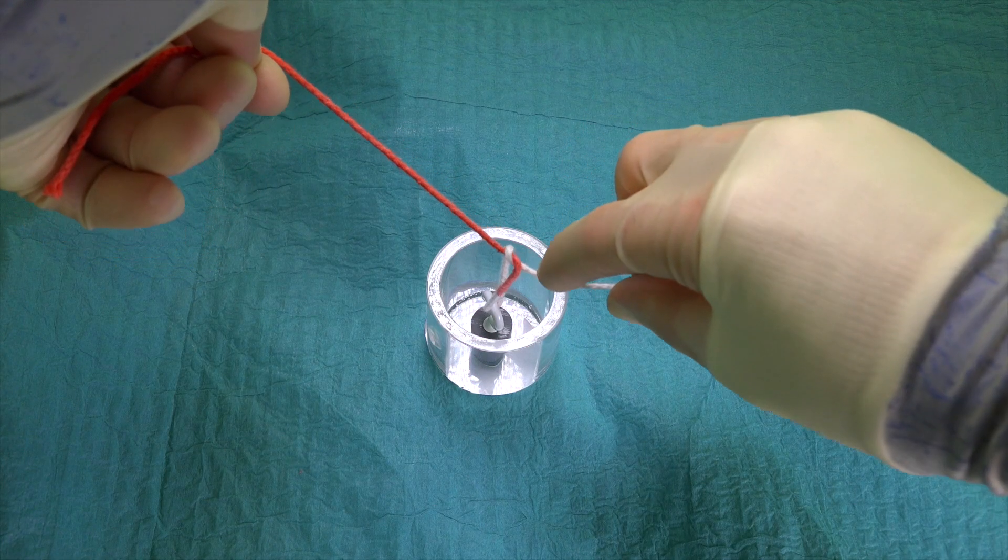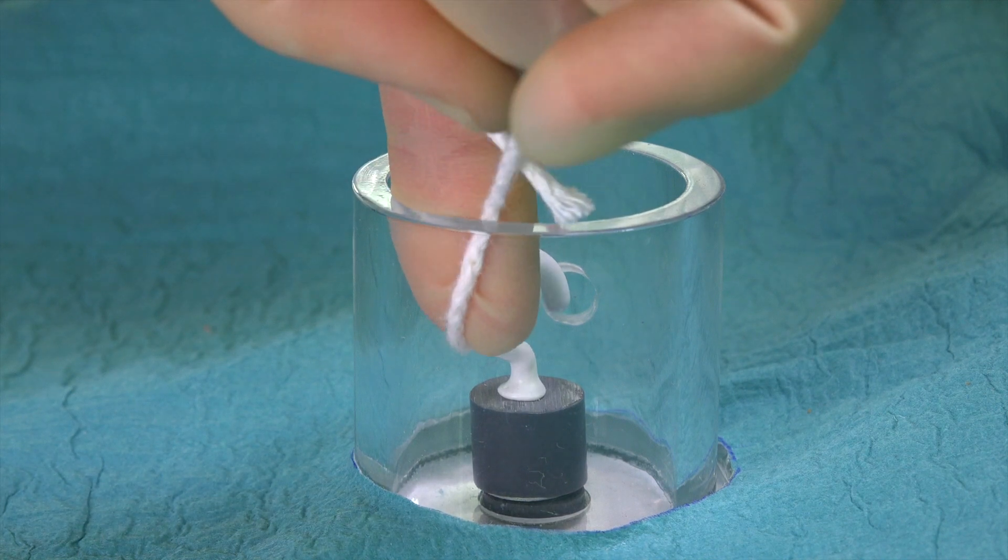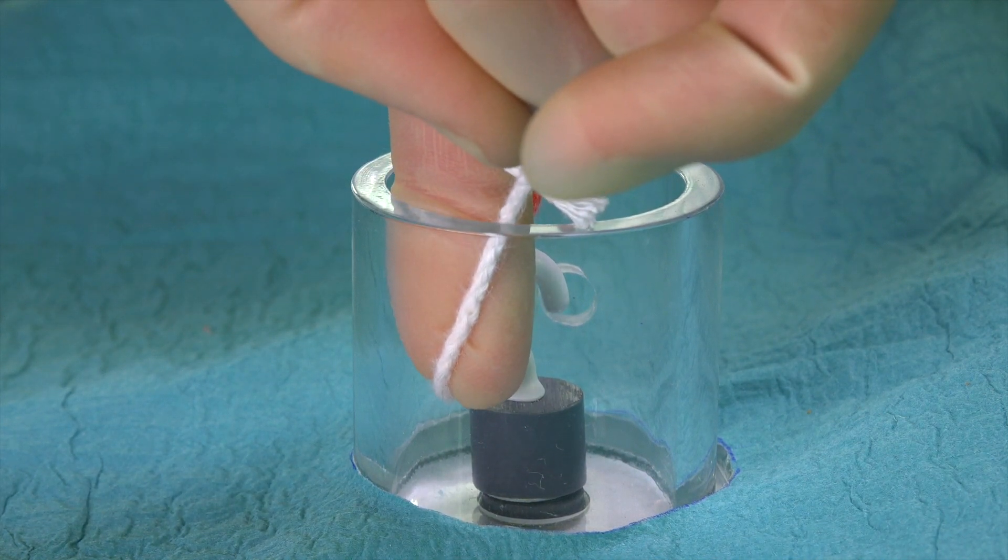We can see how the right index finger is used to gently lay each of the throws down by pressing beyond the hook and not directly onto it.